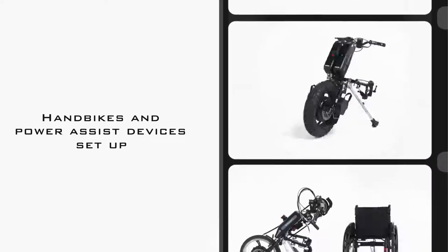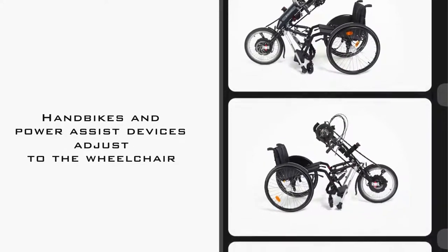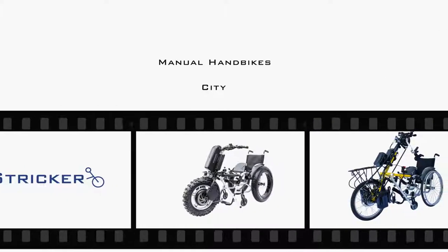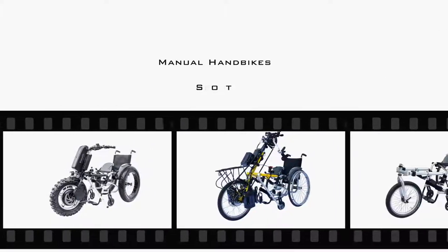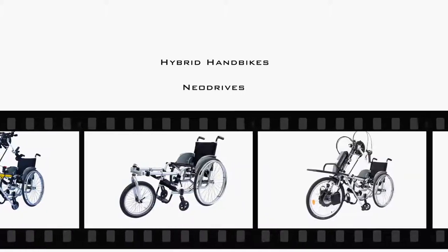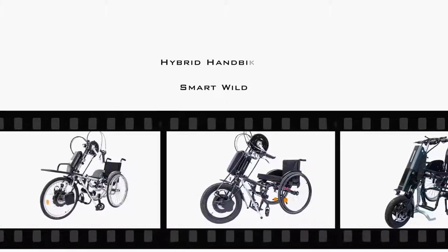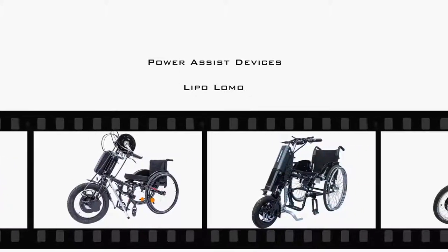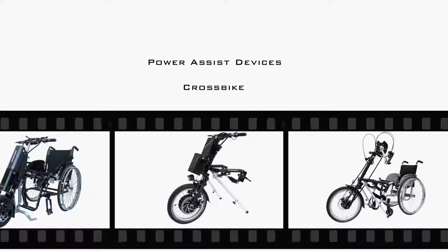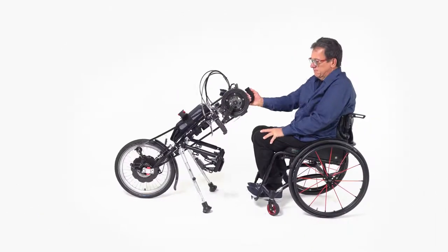We will show you how to adjust them to your individual requirements and adapt them to a wheelchair. The following models can be set up with the help of these instructions: all manual handbikes — City, Sport, Ultra, Lomo, 360; hybrid handbikes — Neo, Drives, Lipo, Smart, Smart Wild; and power assist devices — Lipo, Lomo, Micro, Pico, and Cross Bike.